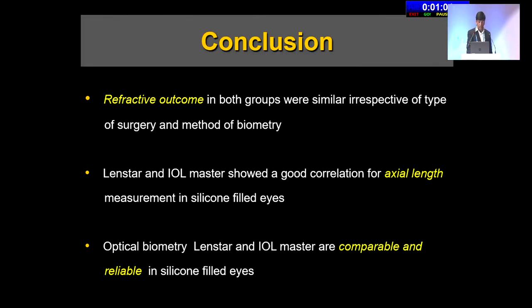To conclude, the refractive outcome in both groups was similar irrespective of type of surgery and the method of biometry. Lenstar and IOL Master showed a good correlation for the axial length measurement in silicon filled eyes. And finally, the optical biometry, Lenstar or IOL Master, is comparable and reliable in silicon filled eyes.